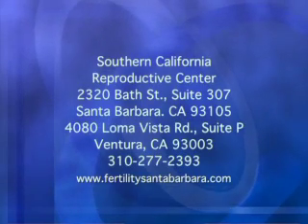And finally, with the use of three-dimensional ultrasound technology, we can determine the structure of the uterine cavity. Some women are born with abnormal uterine structure, and using an ultrasound with salt water helps us to look at and say, is there a partition or septum down the middle of the uterus that can be removed, which would enhance a woman's ability to conceive and stay pregnant.